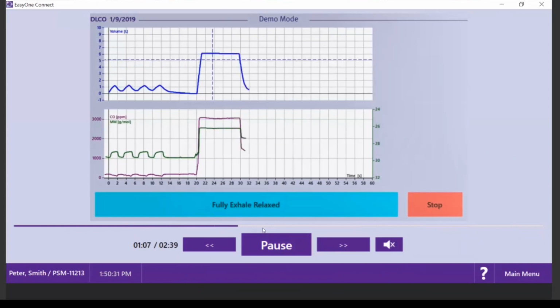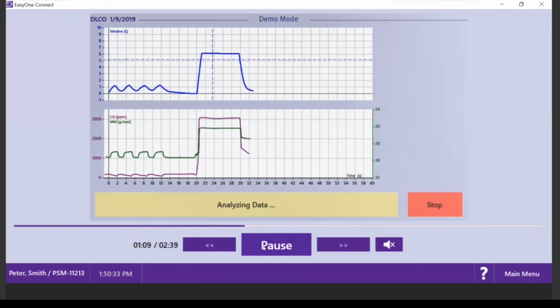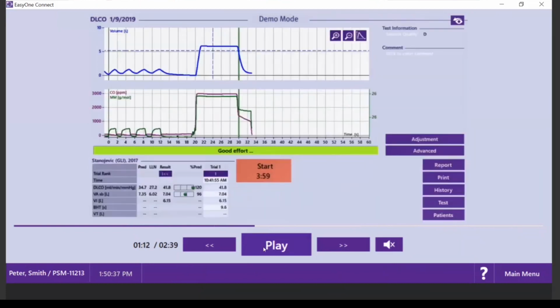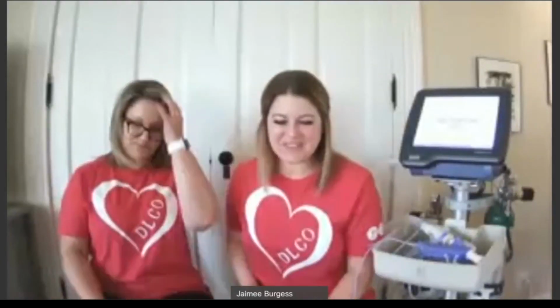Now we do 2 tests 4 minutes apart, but we won't bore you guys with that today. But we did want to show you how simple that 10-second breath hold is for the DLCO test. Thank you, Jamie. Oh, you're very welcome. Back over here. All right. Moving right along.